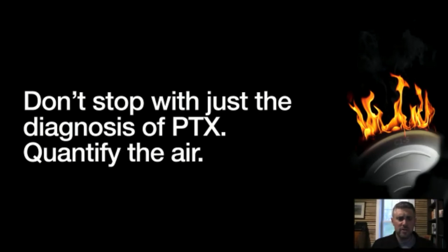And then when you do the scan and you identify the pneumo, don't stop, right? Keep going and quantify how big that thing is, at least in your head, so you can decide what the next step is. And if for nothing else, be one step ahead of the game, so if the patient decompensates, you're aware of what's going on, and you can also be one step ahead of the rest of your colleagues to really know where things are headed with this patient, right?